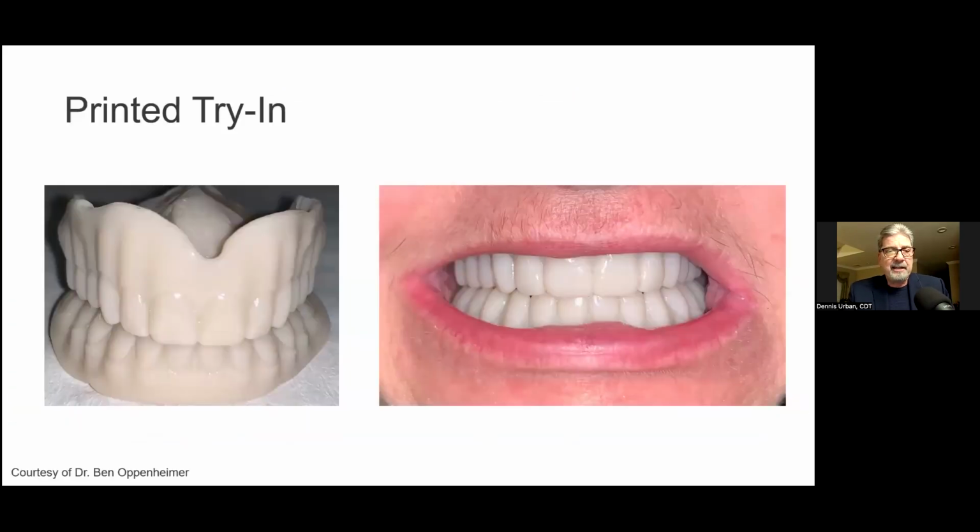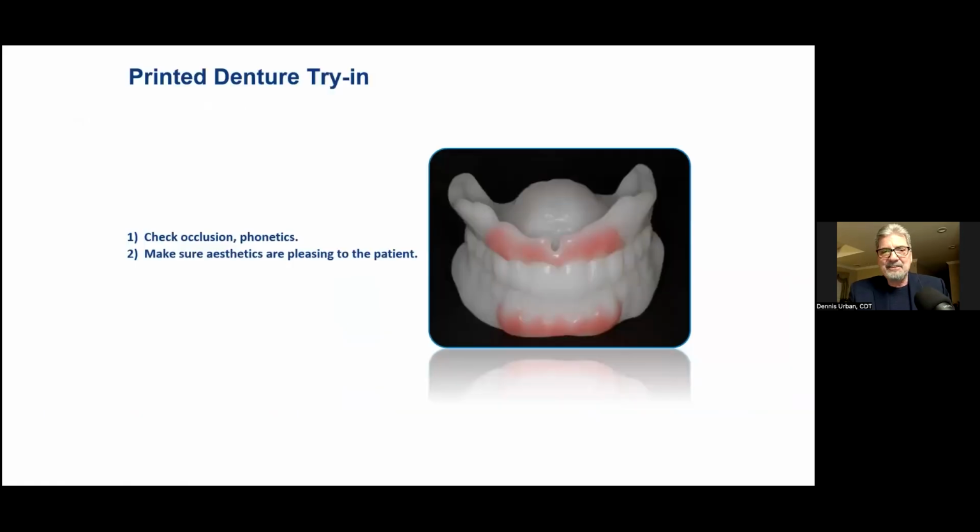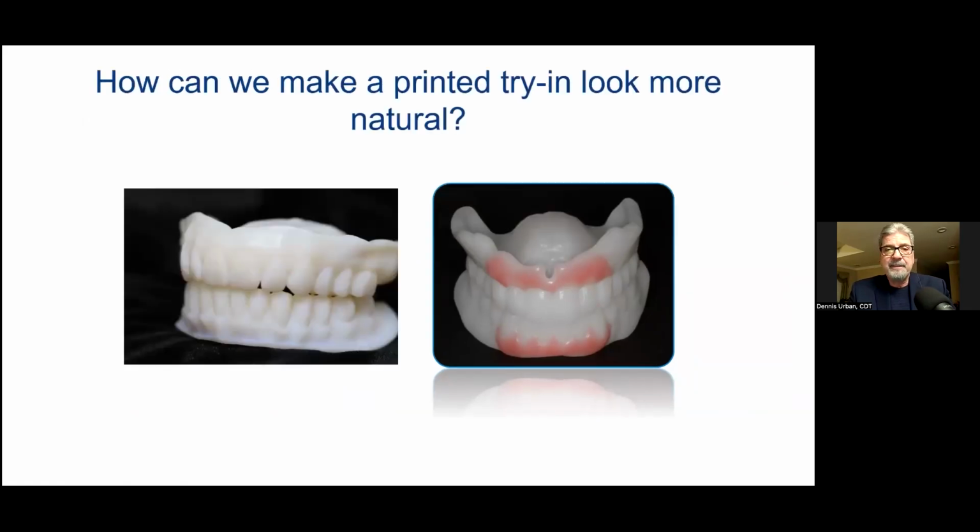So there's your printed try-in, like I mentioned earlier. Big difference from the wax try-in that you saw earlier, right? The doctor's still going to check for occlusion and phonetics. And what's happening now is a lot of the patients go home with their printed try-ins just to get a feel for how the retention and the occlusion are for maybe one or two days, and then come back to the dental office, and the doctor can make the adjustments and send the file back to the laboratory, and we can adjust it in the software.